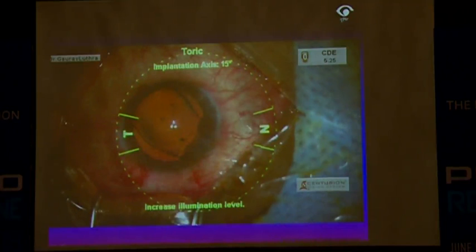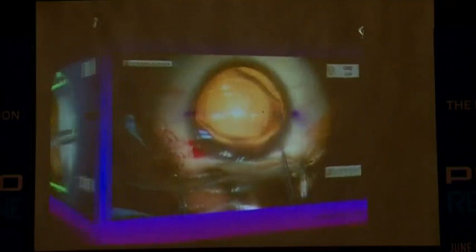So you can manipulate as long as the ICL is not fully delivered. You can abort it and you can maybe do some maneuvers to ensure that this opens the right side way. But the best thing is to be careful not to let that happen, as I said before.